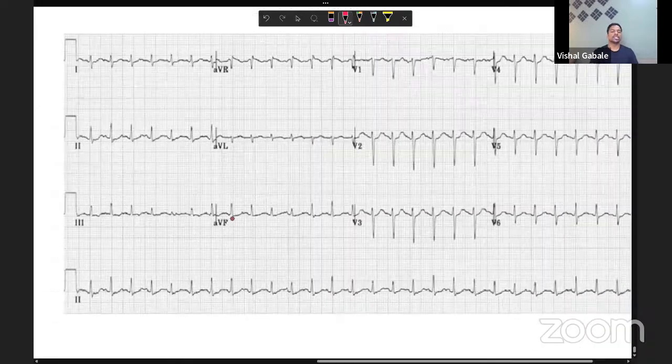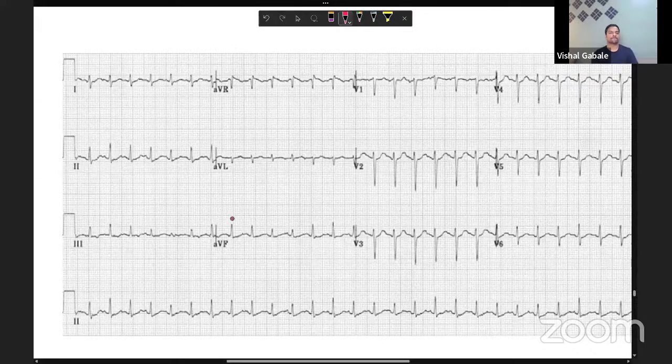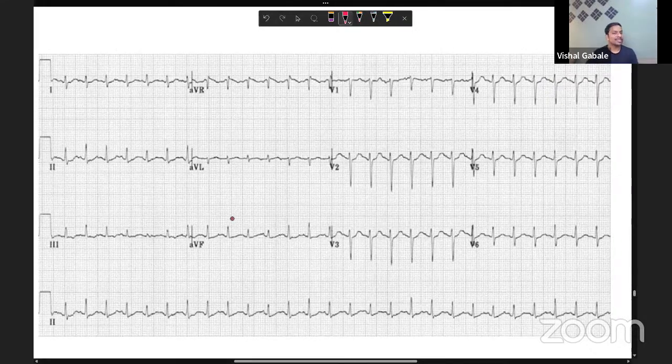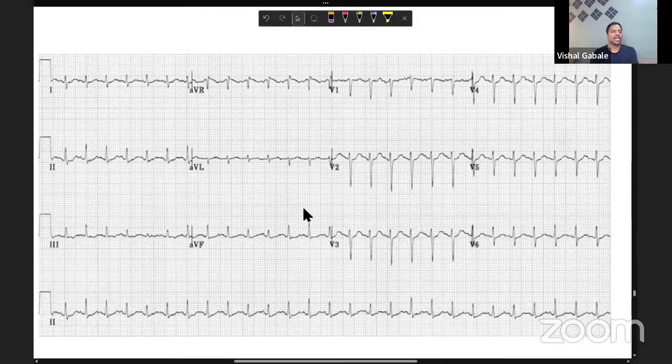So the first ECG is this. Can you tell me the cause? So let's start discussing the sinus tachyarrhythmias. Basically, the first one is sinus. Can anybody tell me the name of this arrhythmia? Quickly, guys. Anybody? Yes. Quickly. Very good. This is sinus tachycardia, right?